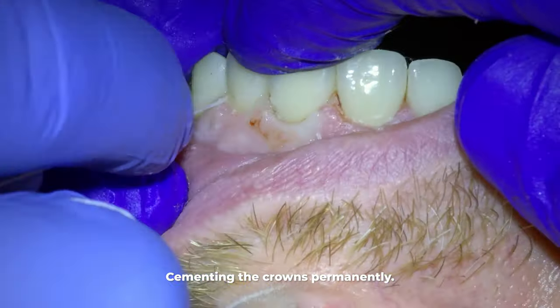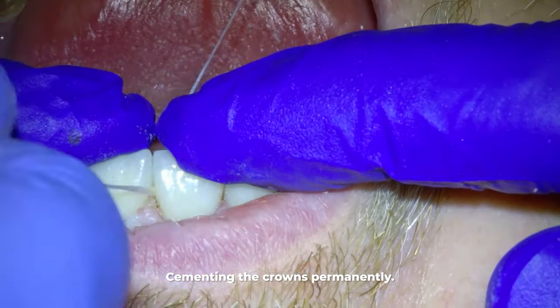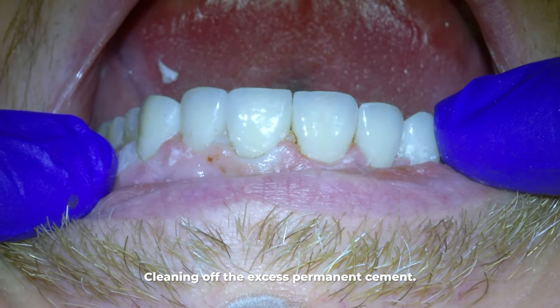Because our patient was completely happy with cosmetics and the crowns all met the other four criteria, we cemented the crowns that day with permanent cement. We then clean off the excess cement, and there you have it — the crowns are done.